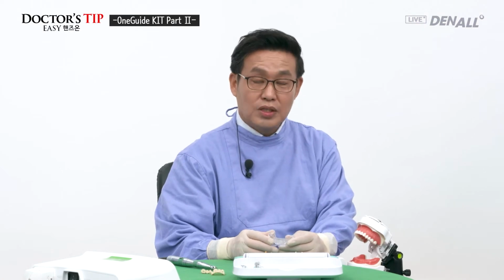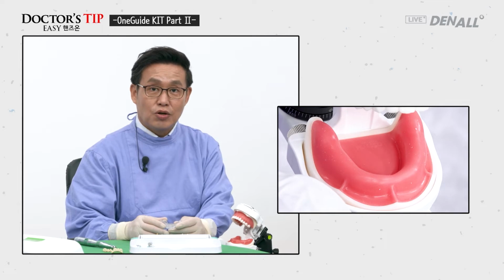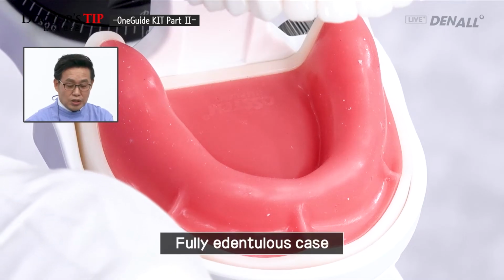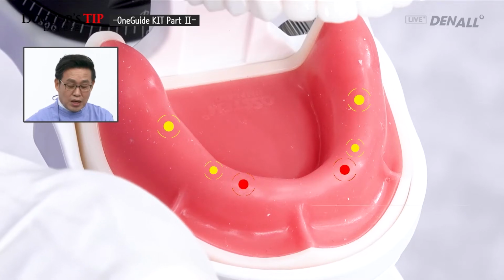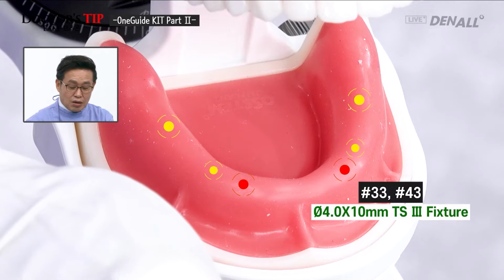The second hands-on is a fully edentulous case. We're going to use vertical and lateral anchor to adapt the surgical template and place the implant. It's fully edentulous case, and we're going to place implants on canine, first premolar and first molar on both sides. On canine, in other words, number 33 and 43 on both sides.